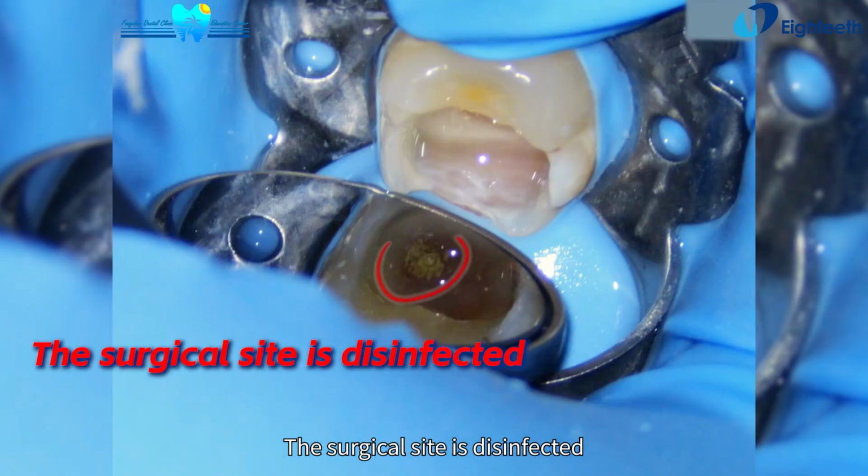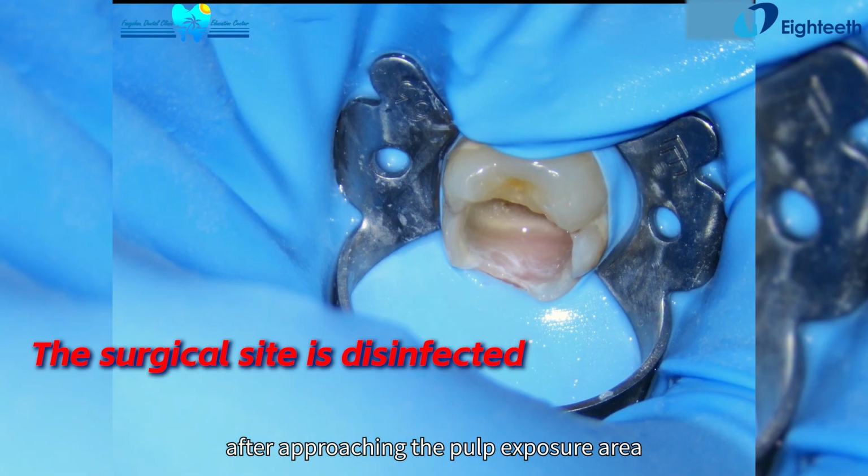The surgical site is disinfected after approaching the pulp exposure area.